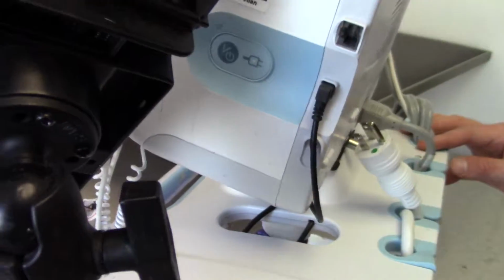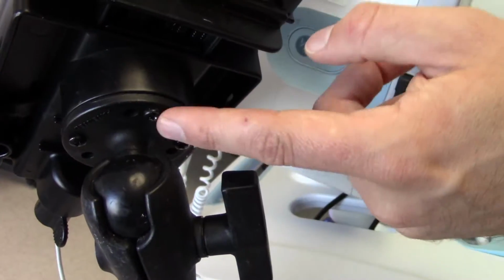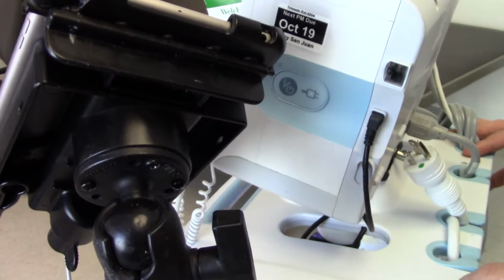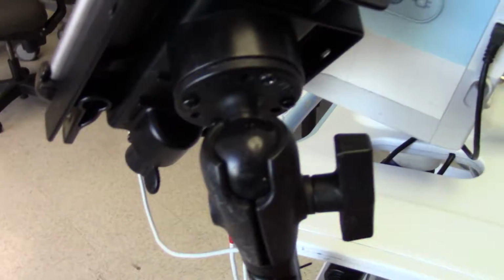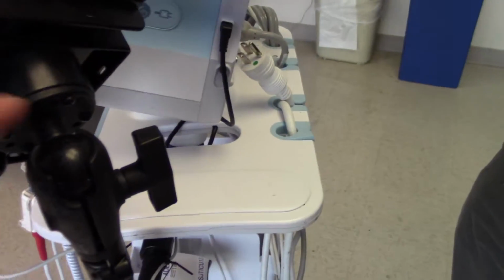No, this is part of their system. They create modular systems. So this has its spacing of the bolt holes here, that's all spaced out so it mounts into this little pedestal. Oh, okay, but is this made by the same company? Correct. Everything you see here is all the same company, Ram Mounts. Oh, okay. So even this thing. Correct.